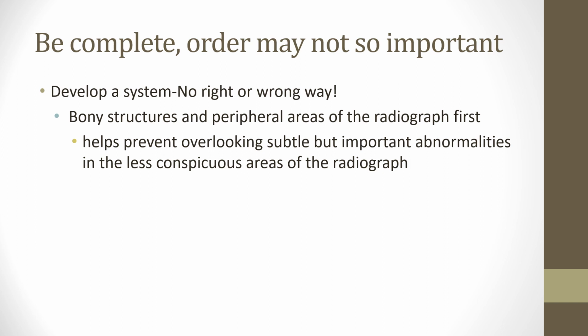So the big thing here for you guys ultimately is to develop your own system. Now I had my own system. I had the A through I technique that I go over in that other YouTube video. But this one it's sort of up to you. There is no right or wrong way as long as you are able to evaluate everything. Make sure that you pick it and stick with it, right? There are many different ways to do this, and that's why I'm not going to limit you to just the one that I do. We just don't want to overlook something that could be important, and that's the big thing. That's why you always want to be very cognizant that you're going through all the detailed steps, right?